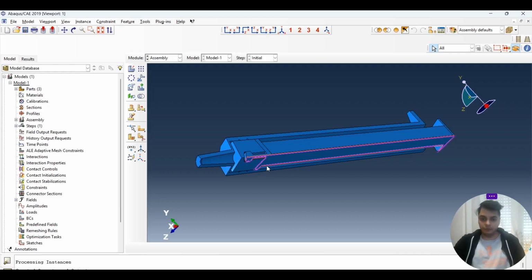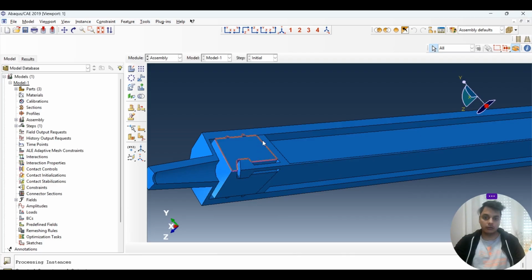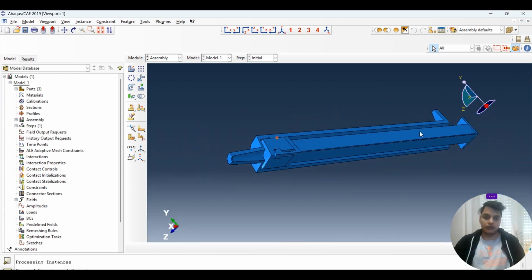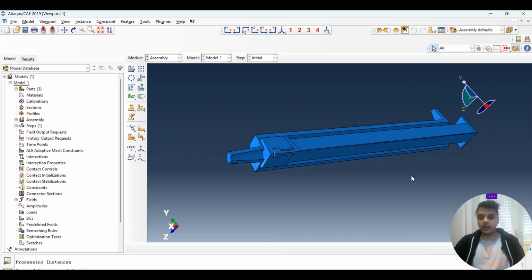What we can do later on is put on the symmetry, because of which we can have the other parts also, but for our use case it's good enough so that we can understand how much contact pressure the rubber is going to put, so that we can understand the reaction forces. For example, why we need to do this analysis is a very basic question. We really have to understand the purpose of syringes. We have to understand how much force we need to push and pull the syringe. That's one of the basic things that we have to understand.